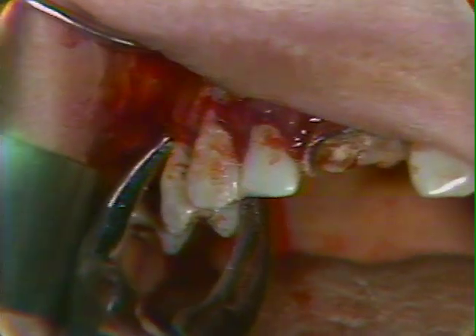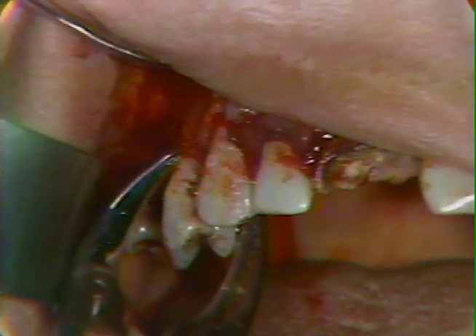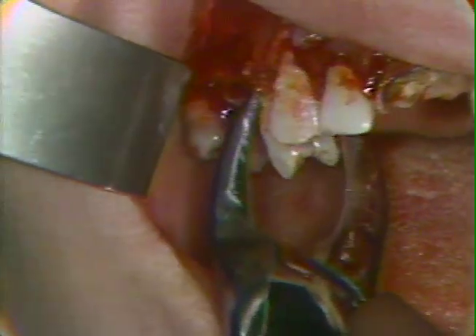I slide up on the palatal side, I slide up on the buccal side, and then, giving the maxilla some support, I'm trying to manipulate the tooth in both a palatal and buccal direction. In so doing, I find a path of more or less reduced resistance to that manipulation, and on each excursion of the forceps, I try to move the tooth in the direction that it is yielding.